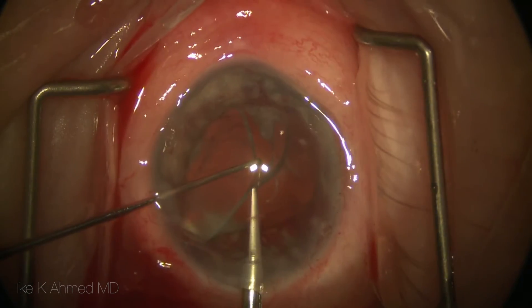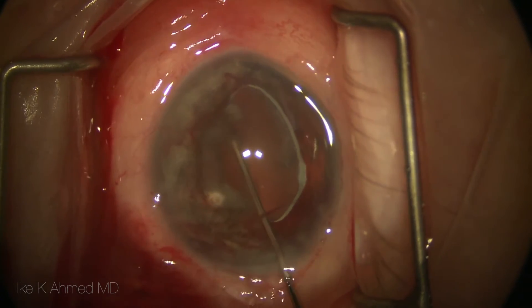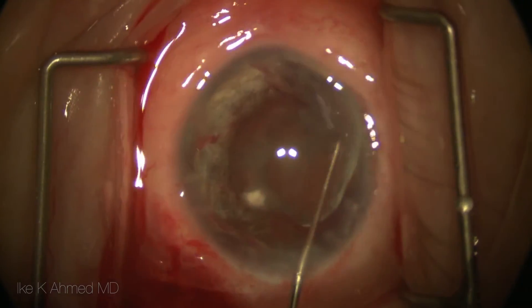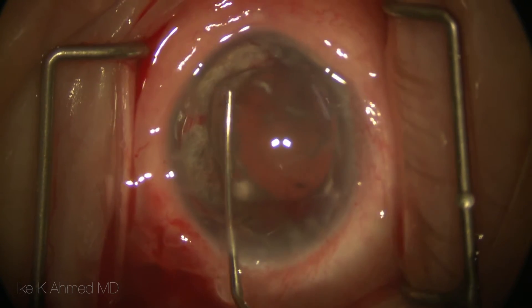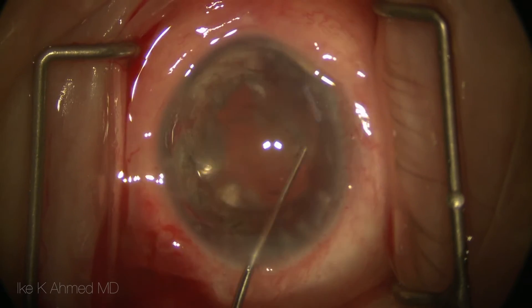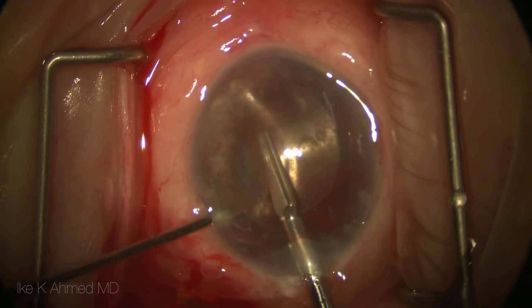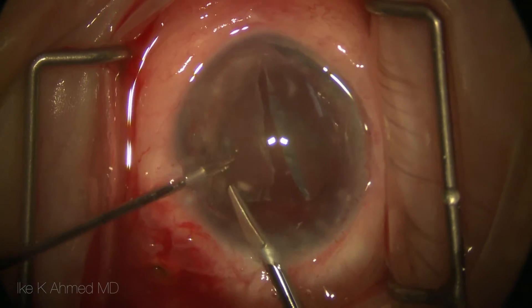There is a fair amount of fibrotic tissue around the haptic. In this case, the haptic is cut from the optic and the optic is then rotated, leaving the haptic in the capsular bag at this time. The second haptic is distracted from the capsular equator fairly easily, with some fibrosis and cortical remnants and Soemmering's rings present. This single-piece acrylic lens is now bisected and removed from the eye.